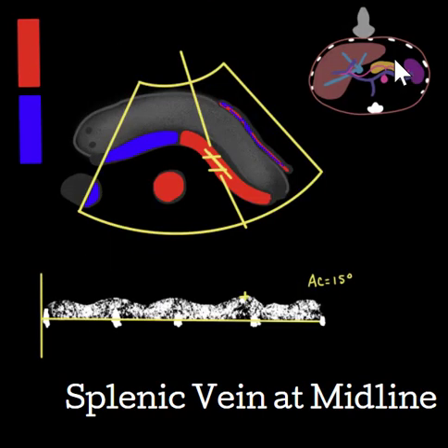Next, hold the transducer in transverse. Using an anterior abdominal window, find the splenic vein at the midline. It will be red as it courses along the posterior edge of the pancreas. Pulsed wave Doppler should show steady or phasic flow above the baseline. Some artifact may also be present from the aorta. With angle correction on and less than 60 degrees, measure the fastest velocity recorded. Evaluate for patency and flow direction as well.